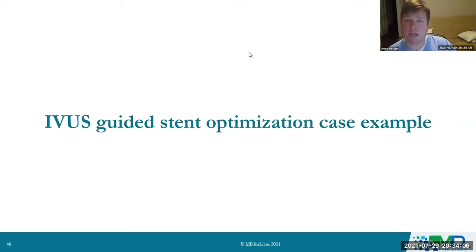It's only really in the case of the left main coronary artery. And then I use intravascular imaging or IVUS to look, as I said, to figure out where those 100% blocked blood vessels come from to make that procedure more elegant, safer, and more efficient for the patient. But IVUS is used, generally speaking, in conjunction with stenting, with balloon angioplasty, with atherectomy, and then in assessing vessels for lesions that need to be treated.